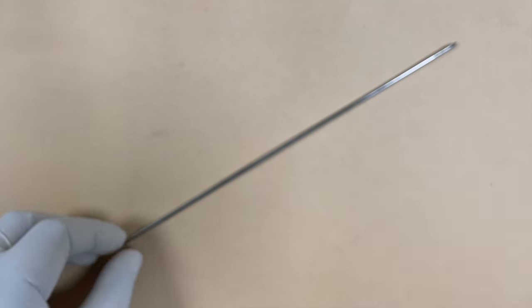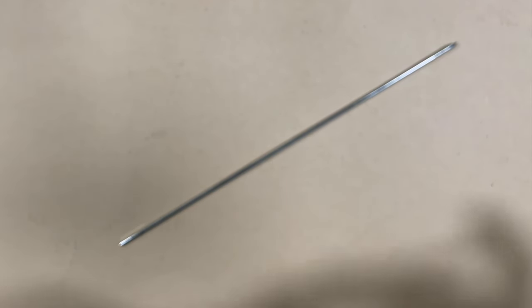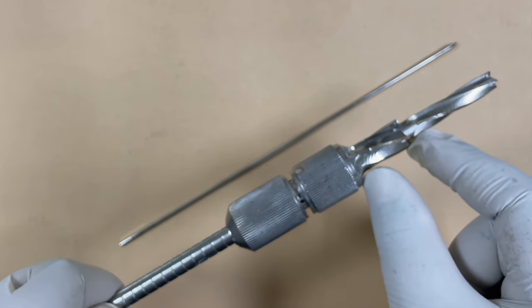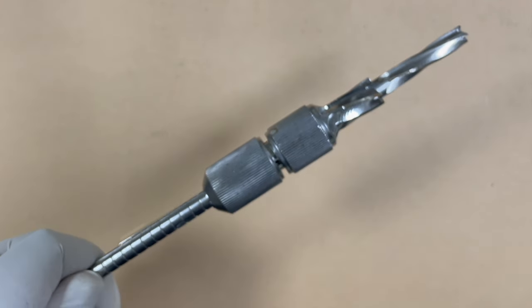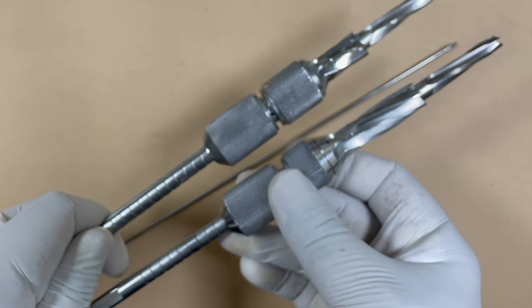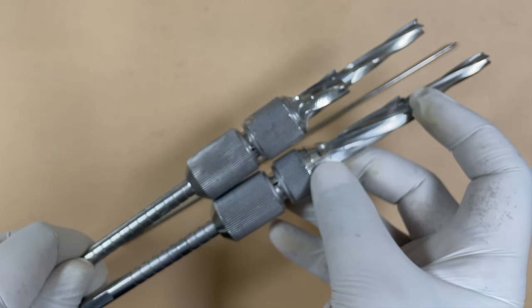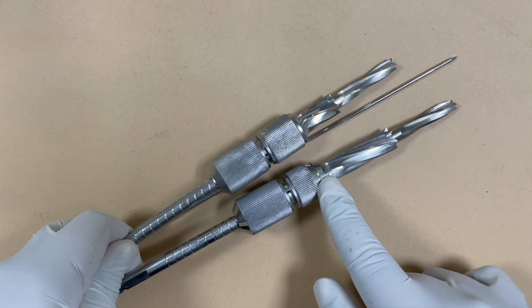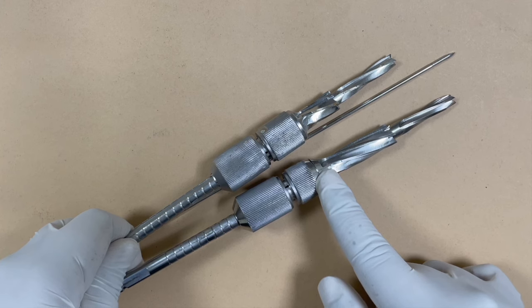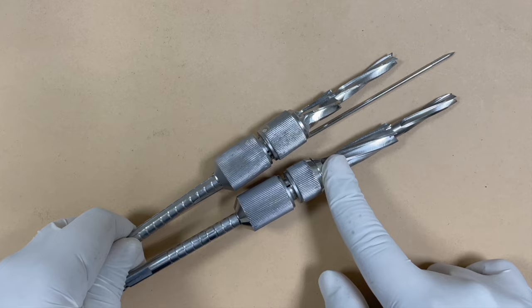Now the guide wire is in place. You have to set your triple reamer after that. If the screw is coming out to be less than 85 millimeters, we use the short barrel triple reamer. But if it is more than 85 millimeters, we use the long barrel triple reamer. This is because in longer screws we need a longer barrel plate, while in shorter screws we need a short barrel plate. So we select the triple reamer accordingly.